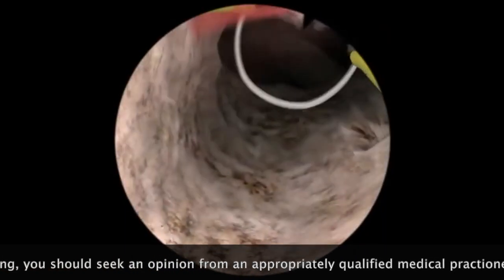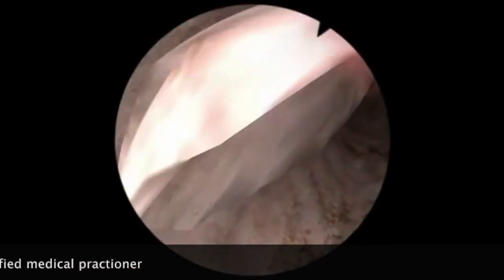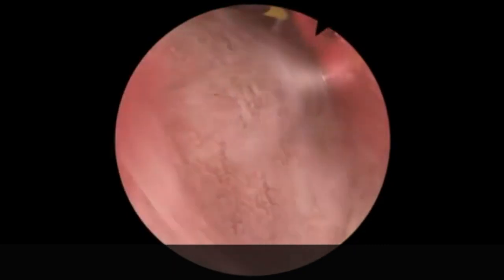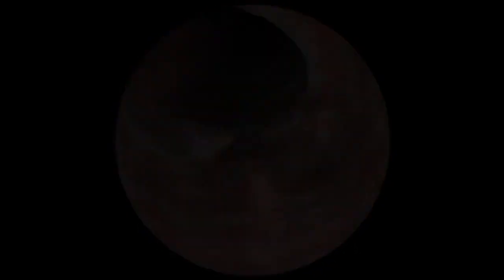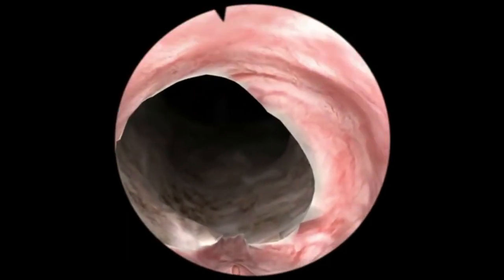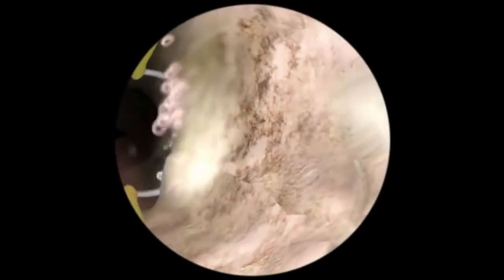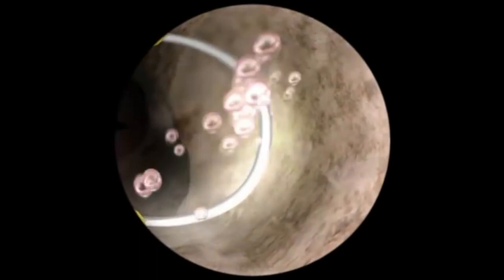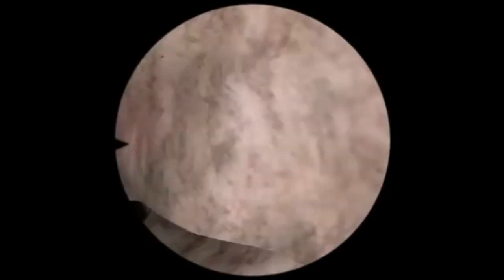Small blood vessels are diathermied as they are encountered. The cavity is opening up nicely, giving a wide channel through which urine can pass.